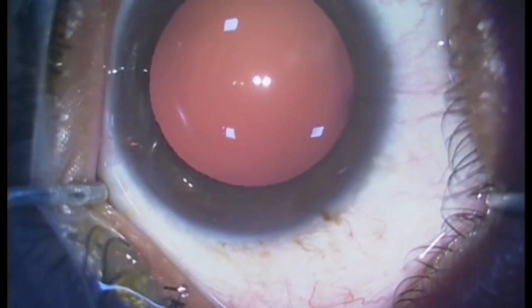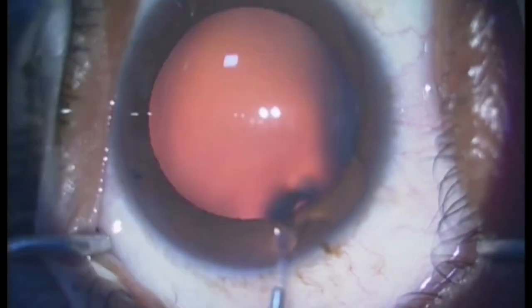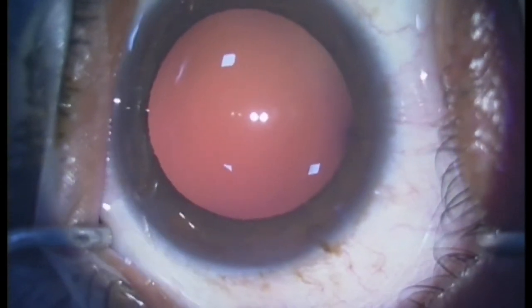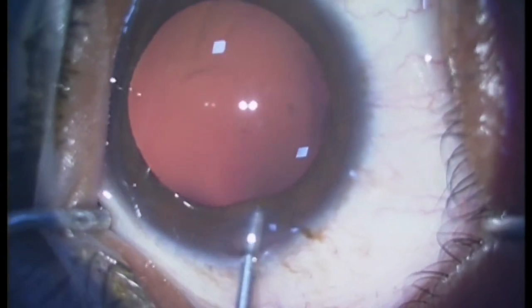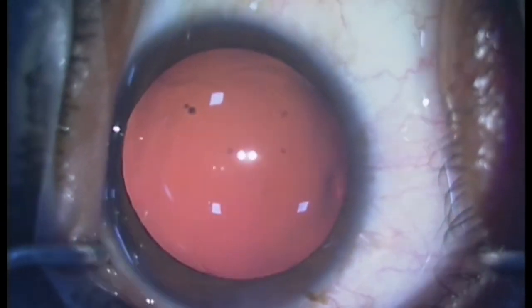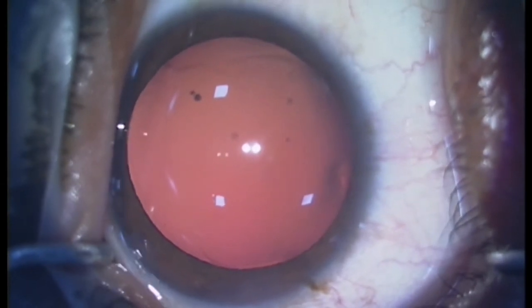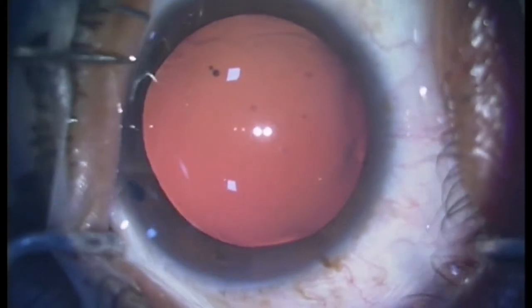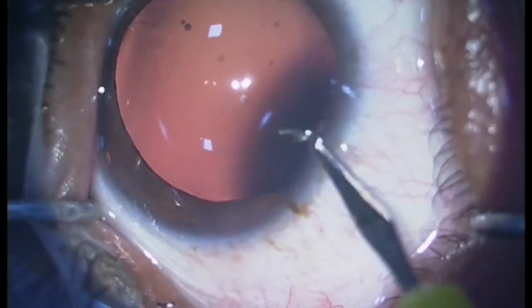This is followed by injection of preservative-free intracameral lignocaine and HPMC viscoelastics into the intracameral space to create a space between the corneal endothelium and the surface of the crystalline lens. Another side port is made at the infero-temporal quadrant.